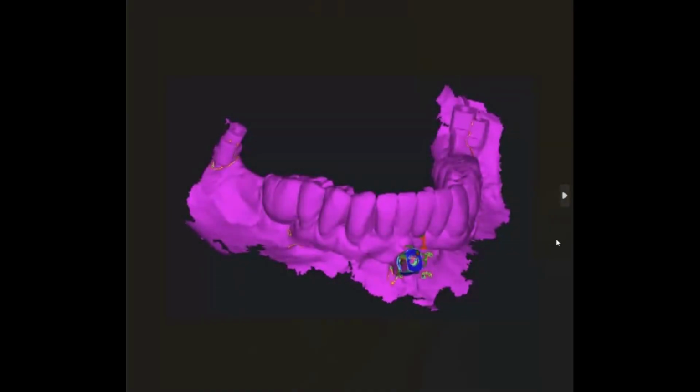This is where we overlaid all three scans, okay? Now on this particular scan, this is where we overlaid the midline on top of itself. When you scan it, we scanned each one 3 times. And when we scan the midline, look at all the blue. The blue shows a good mesh. So 3 scans over top of each other. In this case, this image is just 2 of the 3 scans. 2 scans over top of each other with good alignment on both.